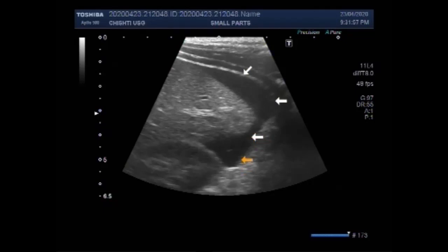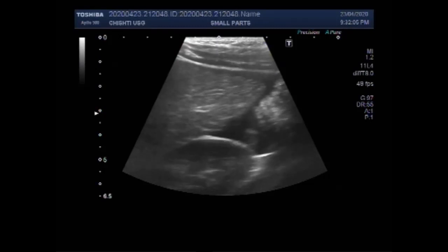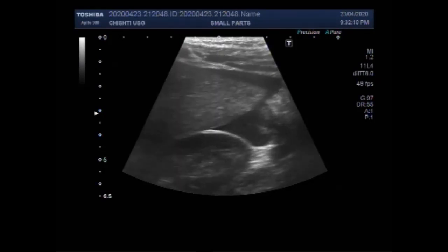The use of ultrasound is an important component of hospital point of care (POC) examination for pediatric and adult patients suffering from traumatic injury when there is potential for intra-abdominal or intrathoracic hemorrhage.